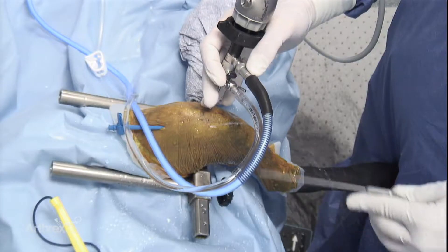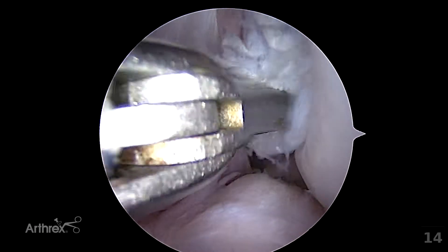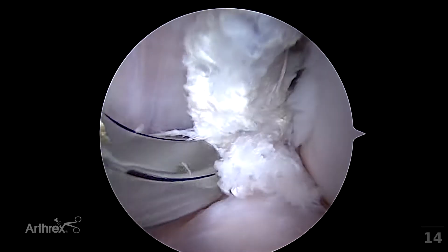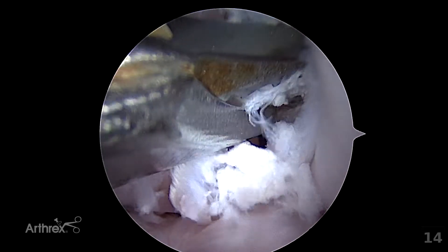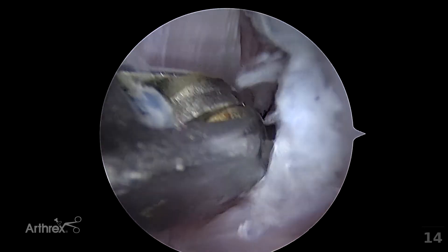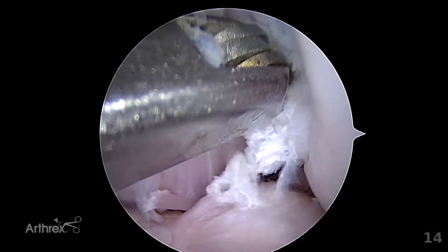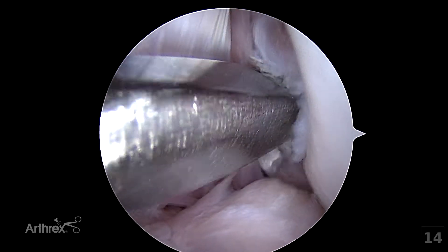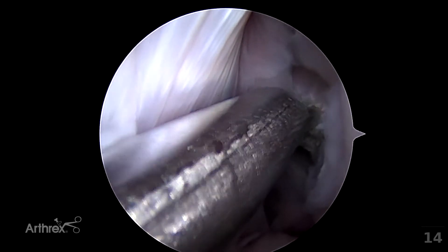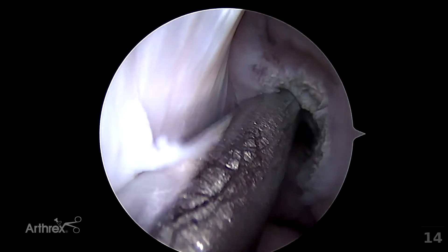Further shaving using the three millimeter shaver may be attempted at this stage. If one is struggling with the shaver, use of the punch to resect the ligament stump may be beneficial. By breaking apart the ligament remnants, the shaver is more effective. It is very important when using the punch in this area not to damage either the caudal cruciate ligament or the meniscofemoral ligament of the lateral meniscus. The particles of ligament detached by the punch will be collected during the debridement and shaving process. The origin of the cranial cruciate ligament can now be seen on the notch wall, and debridement of this ligament is nearly complete.